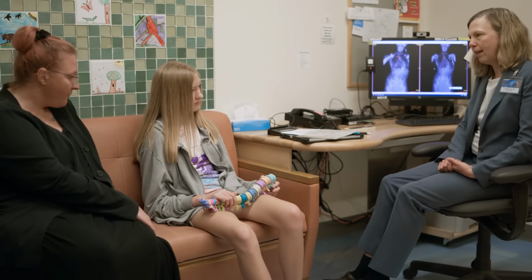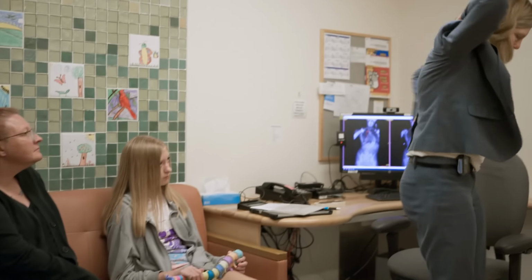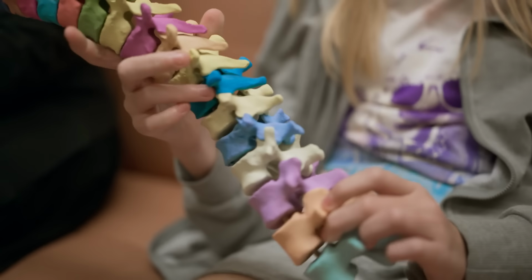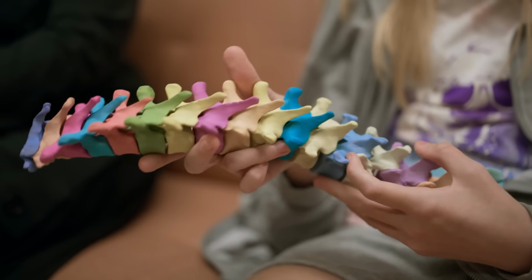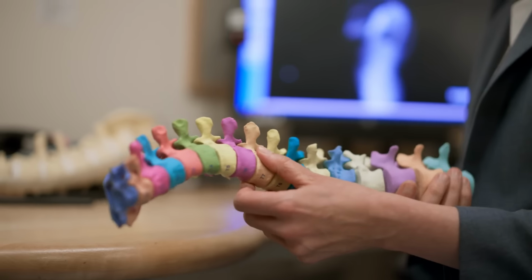While you're asleep, we make an incision over your back, and the incision is kind of something like this, from the top to the bottom. Move the muscles out of the way, place rods and screws over the back, and then we connect the screws to the rods and pull the spine into a straighter position. We're dealing with unique patients that have a deformity that's probably different from every other child in the world. Having a customized model is critical.